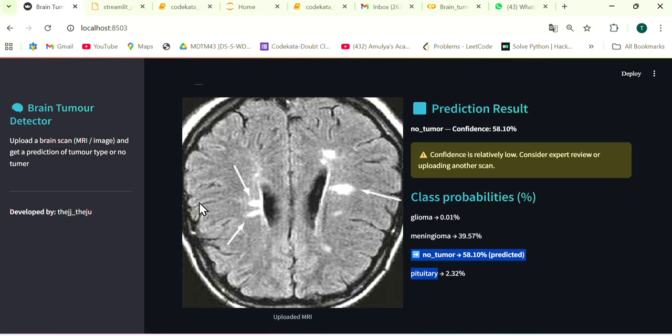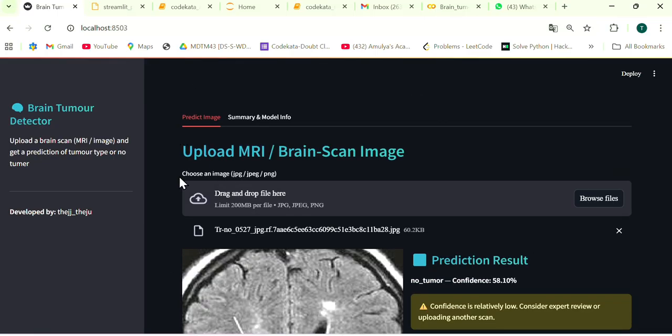The neurologist will look at this particular image and decide what type of tumor it is, or if it is no tumor and all. In this situation, we all know that there is human error. To avoid that, we may use this application as a first step, right? So now we may know how this is contributing in all of the fields.